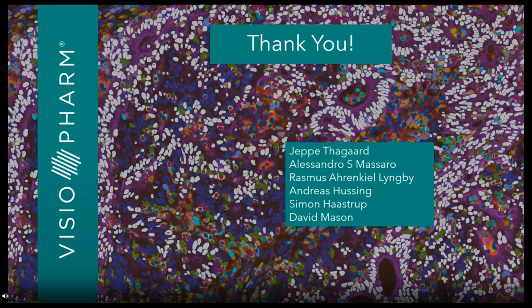And the more general you cut your sections at the same section thickness, the better your model will behave on your samples. But we cannot guarantee that all the cells that are overlapping with each other are identified correctly. And for this, especially when they have the same lineage markers, then it's becoming tricky for the algorithm. But for this, we would like to introduce also in the future that the users can correct for these mistakes. Thanks.